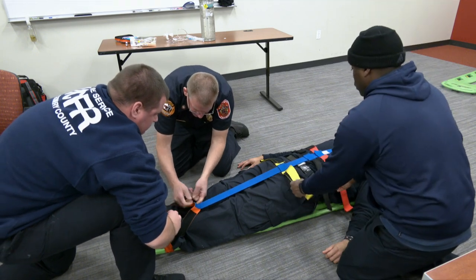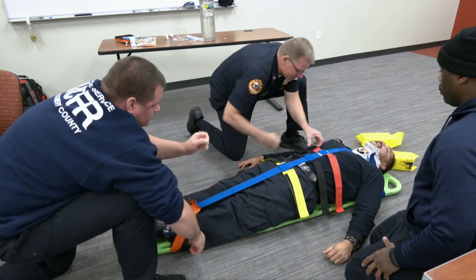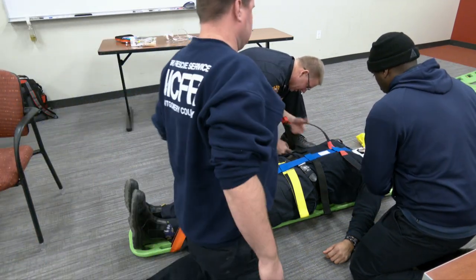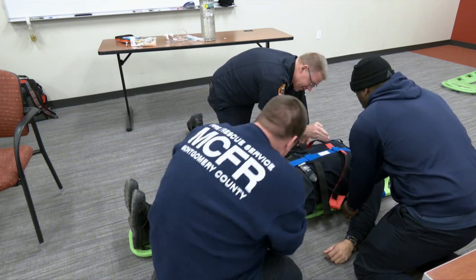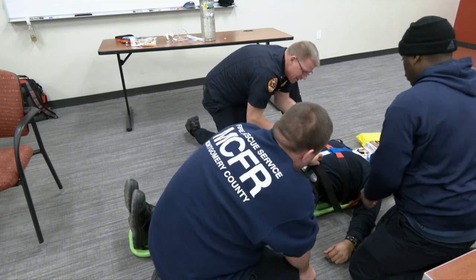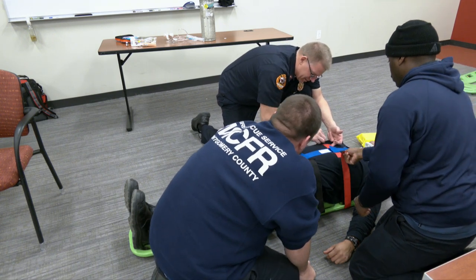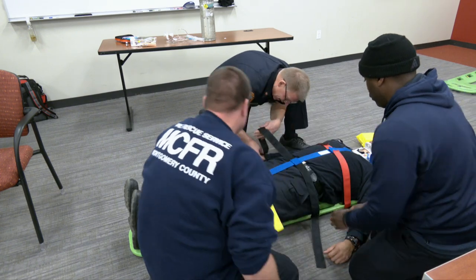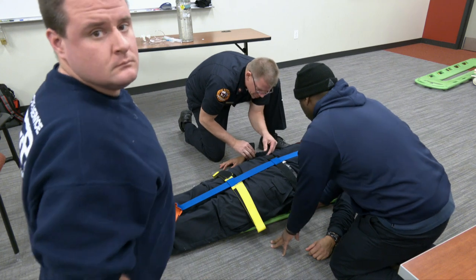That'll work. We cinch that down and we've got it nice and straight. We want this one up in the chest region. When you do this, make sure we don't hamper the person's breathing. Let them inhale — breathe in — and then we cinch that down. Now somewhere around the belt line, can be a little high or a little low. Once again, depending on injuries, you're going to have to adjust these.